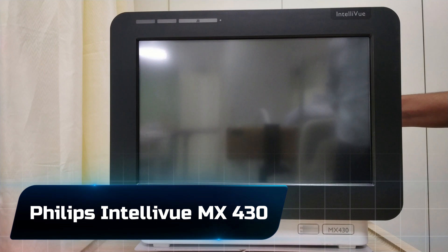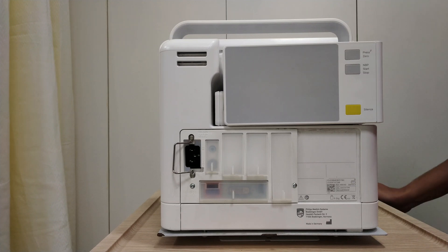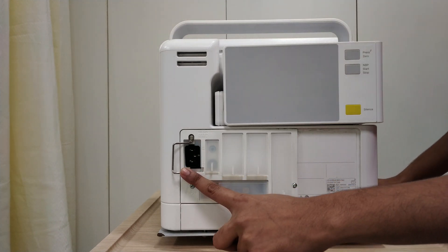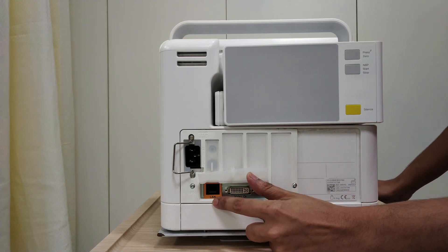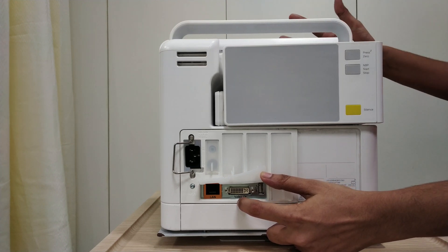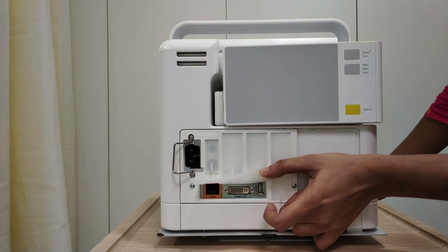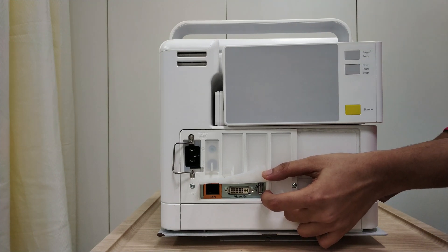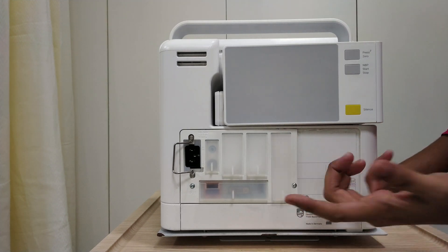This is the Philips patient monitor MX430 model. On the backside, here is the power cord connection. There is a LAN connection so that you can connect your central monitor LAN cable. This is the DVI slot, used for mirroring your patient monitor display to another monitor. Then this is the USB port, from where you can get your event history data. These three slots are for future updates.